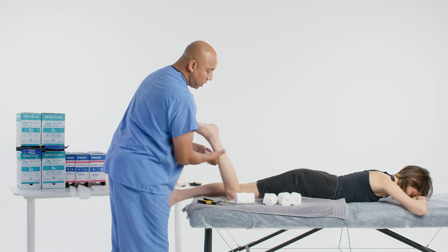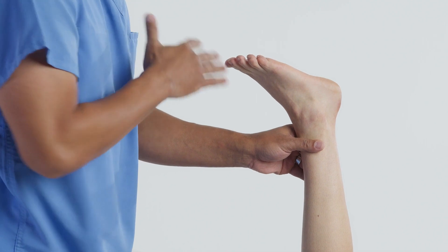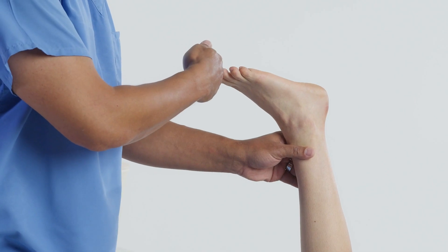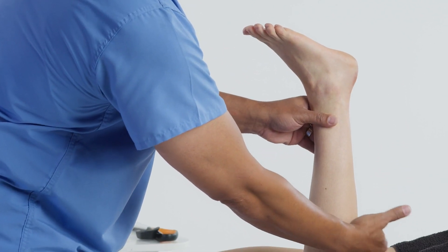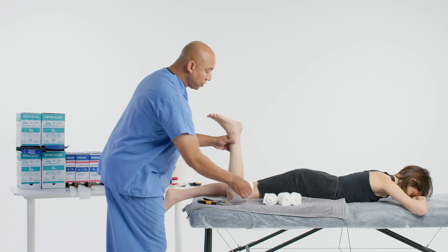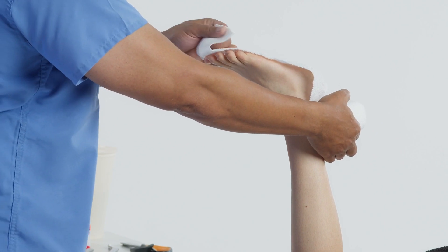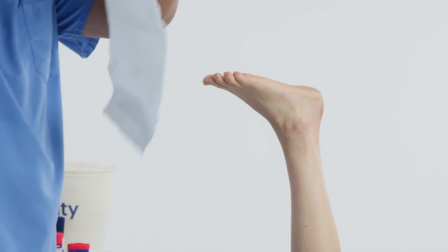Let's go ahead and measure for the posterior splint. We're going to lift the leg up and go just a little bit past the toes for the splint itself, and have a little bumper. When the patient is walking with crutches, they may lose their proprioception and not know where their toes are when they swing through, so we have a little bumper to protect the toes. As we go further proximal, we stop so that at 90 degrees the patient doesn't feel the splint digging into the back of their leg.